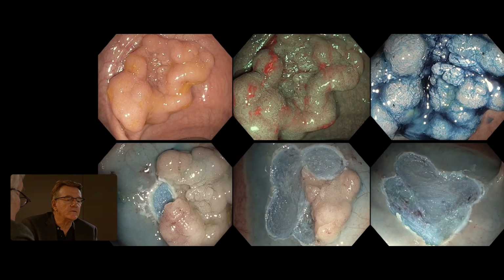This might be considered such an example. So here's a granular lesion and there's a little depression in the middle. So then we always worry, could that be significant? Because the lesion's essentially flat, we can interrogate with what we believe is good accuracy, good sensitivity, 91 to 95%.